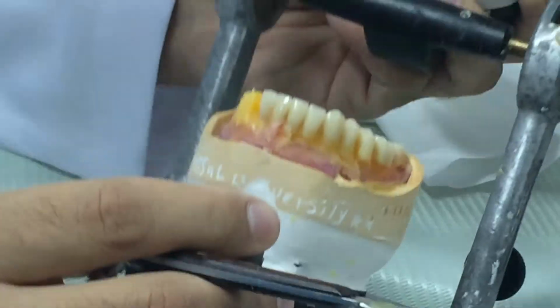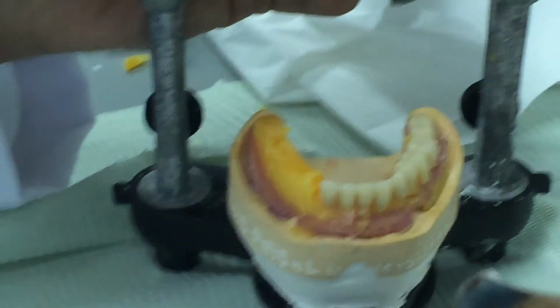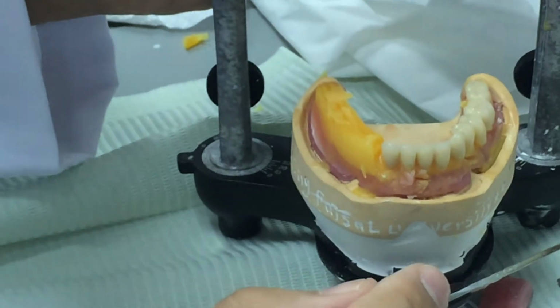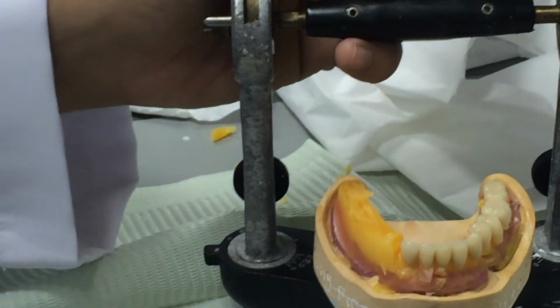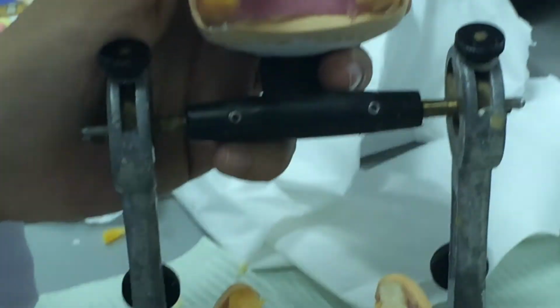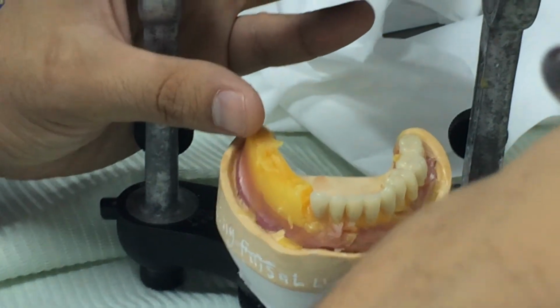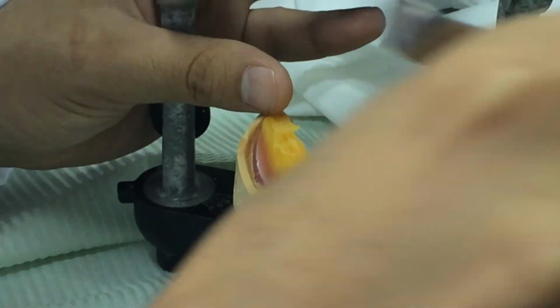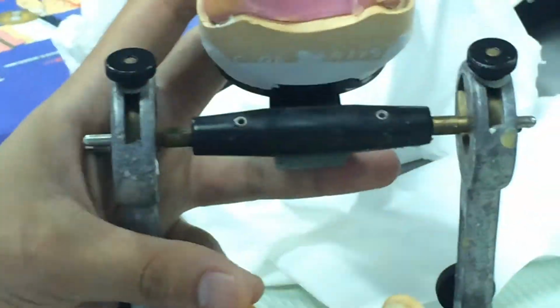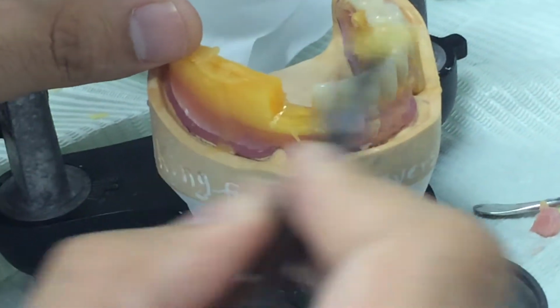And if you can see, I'll give you the relation, the advantage of the guide. We draw something we call guidelines, do you remember them? Abdulrazzaq remembers. Do you remember the guidelines, right, when we drew them on the cast before we started? Before we started the record bases, what did we do? We drew the guidelines, right? The guidelines help me to put them on the crest, it's gonna help me to do the wax rim, right?